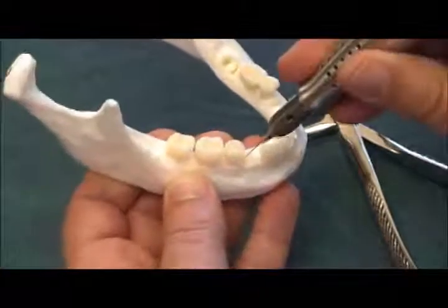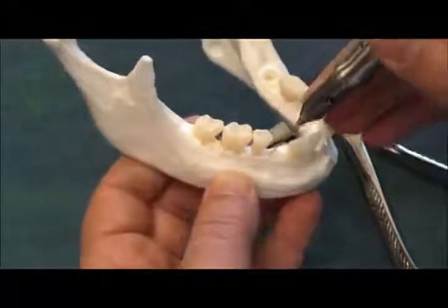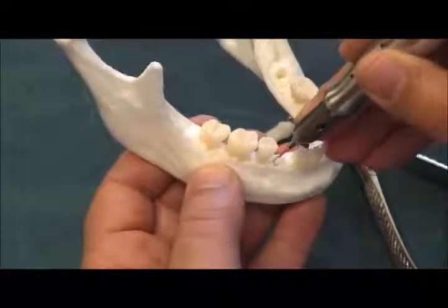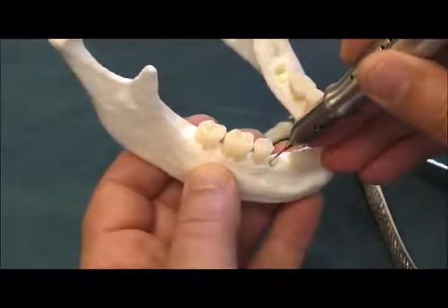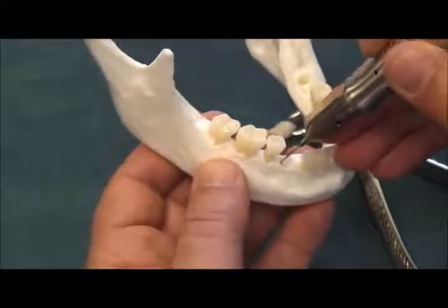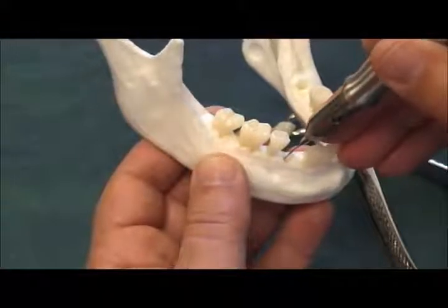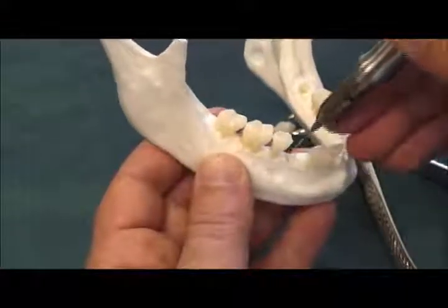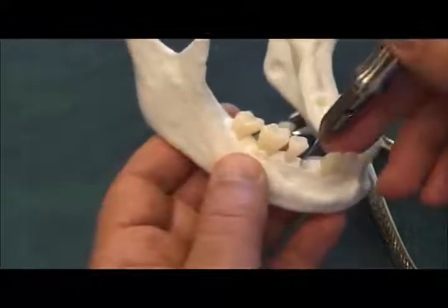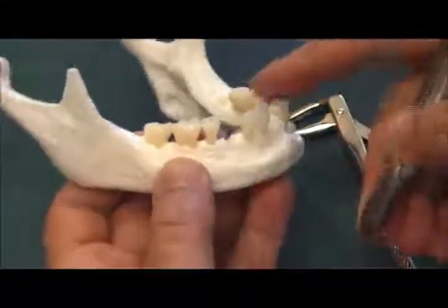With the tip of the instrument too, you really need to know, especially of course in premolar and molar areas, where exactly the mental foramen is, and how close the inferior alveolar nerve is to the tooth sockets. Don't want to perforate through the socket or leave the confines of the socket and potentially damage the nerve. And generally, you can just tell by how deep you're going whether or not you're in the confines of the socket. That really kind of covers everything.